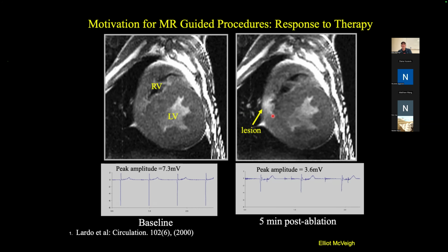And it was expensive. All the equipment had to be magnet compatible, RF compatible, all of this stuff. So it's a really high bar to get in there. And so it really didn't take off commercially.